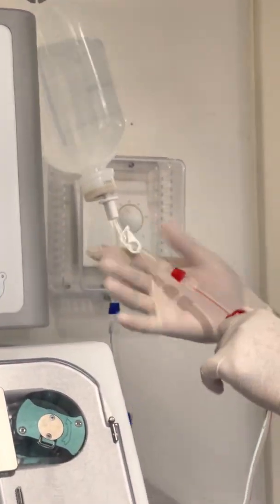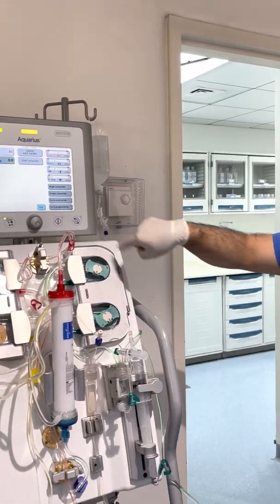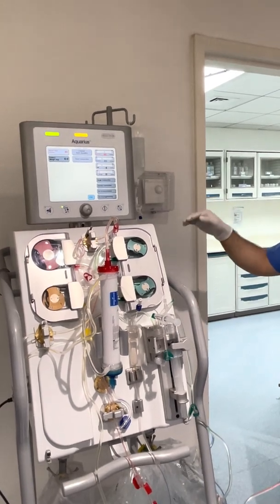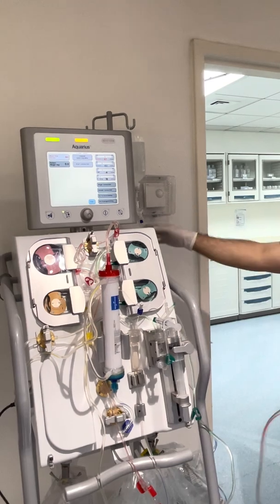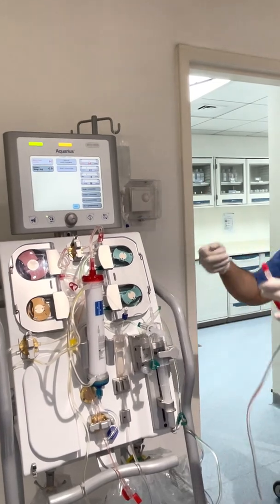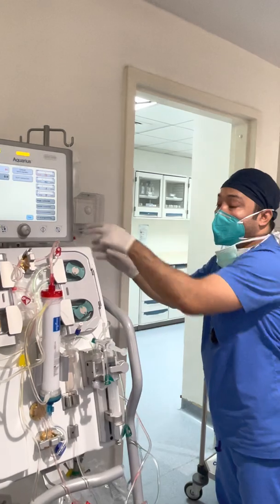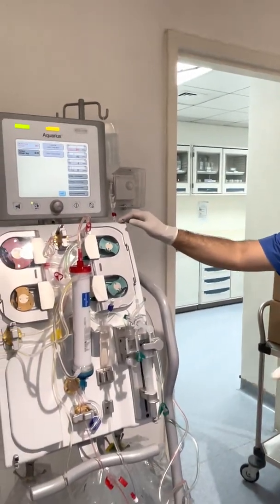So apply first the red one to the patient, then prime with blood so that the normal saline will go outside. See the concept? If the patient is congested, of course you will apply single connection. Fill with blood, then after the normal saline is already out, that's the time you connect the patient. But if the patient is hypotensive, connect right away, so that there will be no waste and it also increases the blood volume.